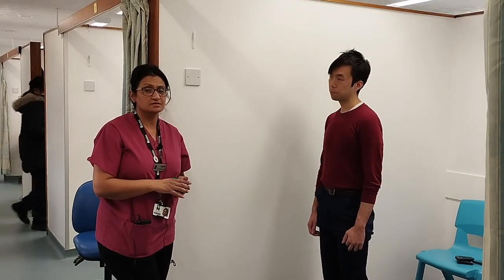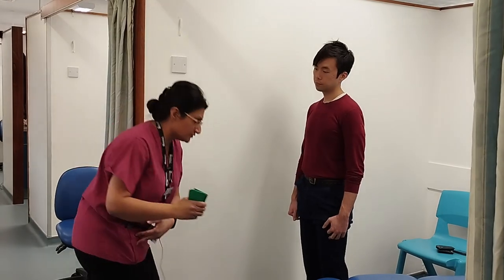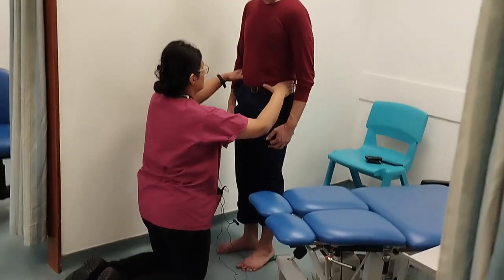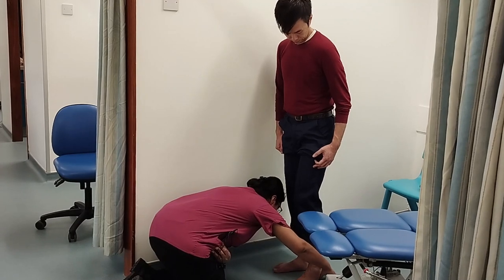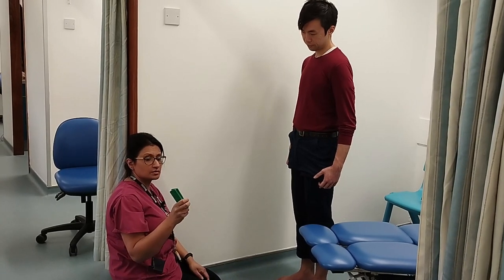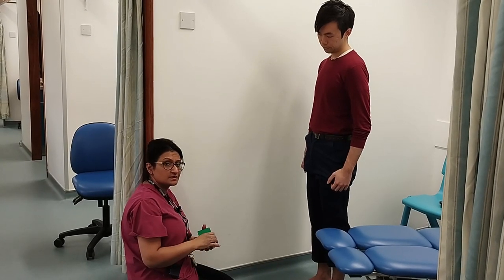In children, the compensations are different — the shoulder tilts to the shorter side. The way we measure is by placing blocks under the shorter limb and seeing how many blocks result in alignment of the pelvis. Placing the block under the heel, we can see that it levels off. Counting the blocks used — one, two, three, four — and they're three millimeters in thickness, so that amounts to about 12 millimeters in total. If we were to place a heel raise in, we would only place less than half — anything between four and six millimeters. However, since the difference is less than two centimeters, we would not treat this.